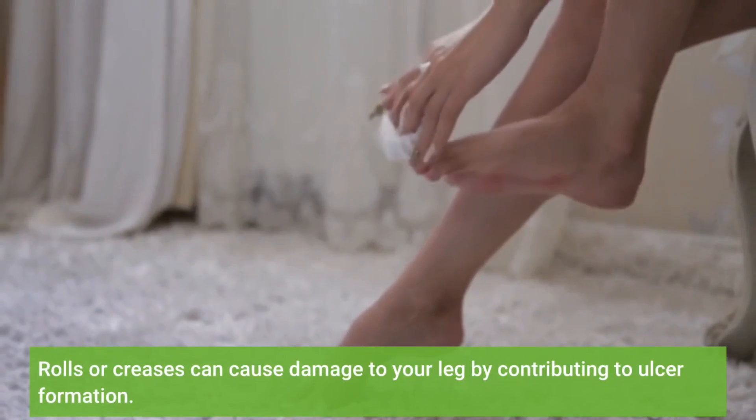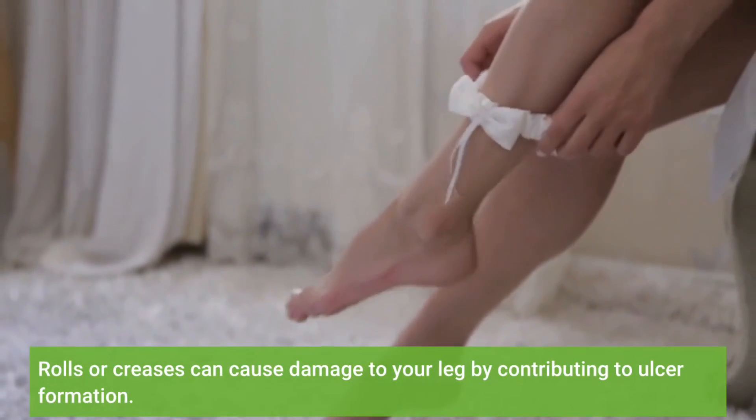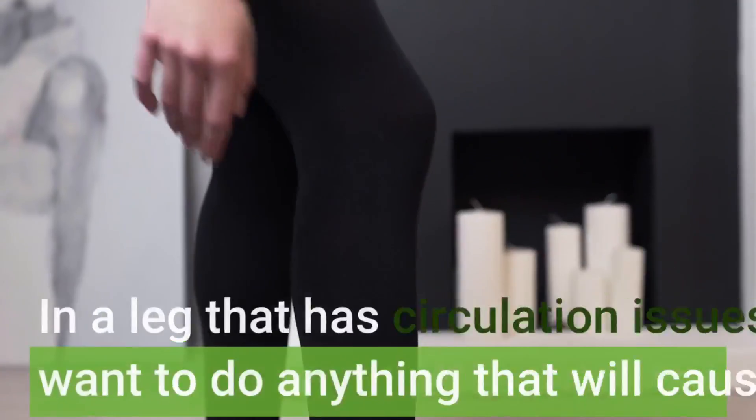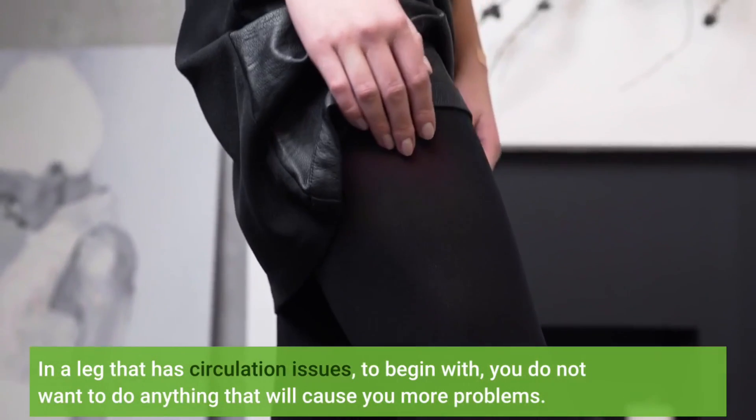Rolls or creases can cause damage to your leg by contributing to ulcer formation. In a leg that has circulation issues to begin with, you do not want to do anything that will cause you more problems.